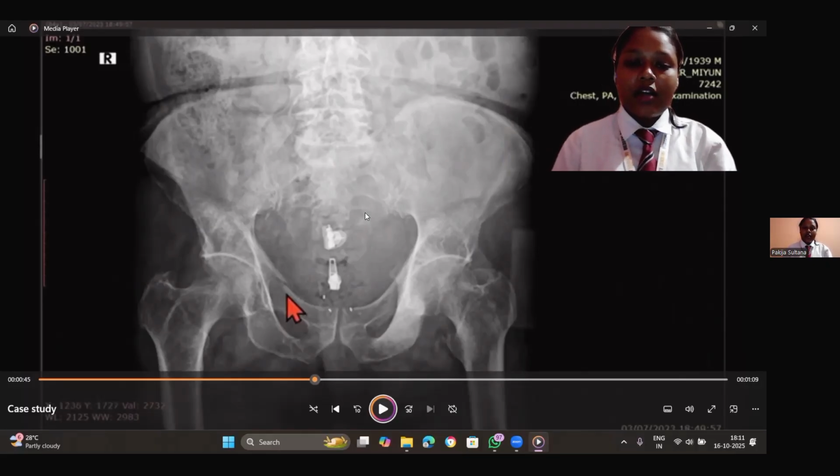The images are acquired with the system at low dose, then transmitted to the PACS system. The radiologist reviews the image looking for signs of cortical discontinuity, fracture lines, or non-displaced fracture. Crucially, the low-dose nature enables imaging without subjecting an elderly patient to excessive radiation risks.